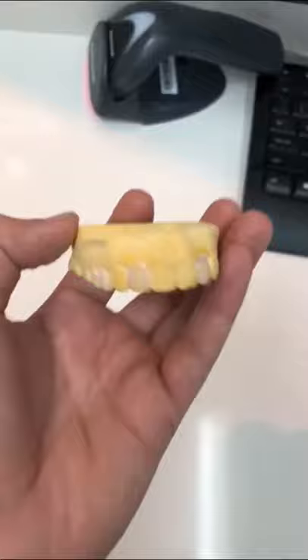When we actually look at it we can see how much we've expanded, so our smile will look nice from every angle. Now on to refining.